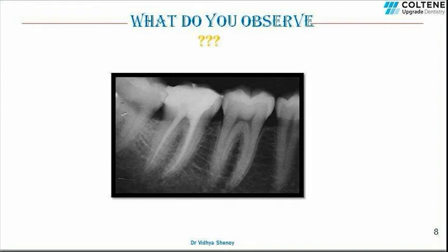So what are our first thoughts in this situation? We'll be thinking, okay, I've done a good root canal treatment, but still the patient is having pain. Maybe there is a missed canal, maybe the cleaning was not sufficient and pulpal remnants are still present. But what we are forgetting here is, this is a two-dimensional image. The radiographic apex and the anatomic apex does not always coincide. So what obturation appears to be till the apex might be actually beyond and encroaching the periapical region, which might be the reason for the patient to have pain.